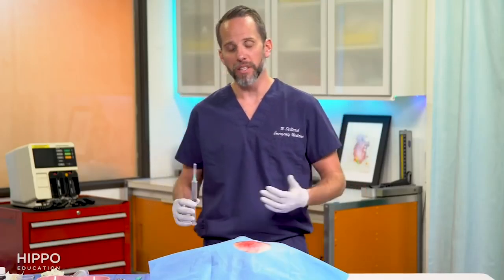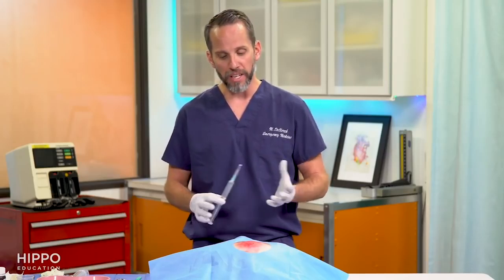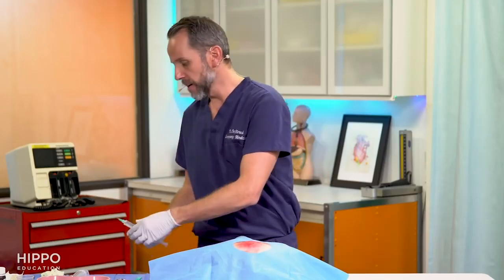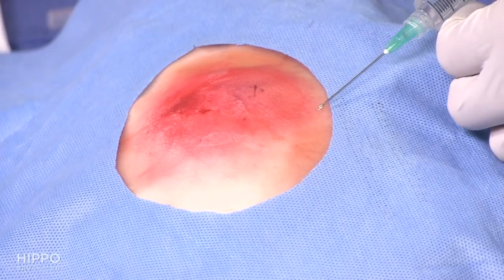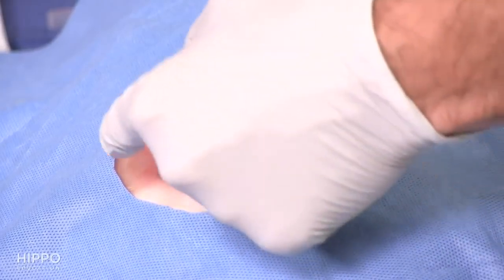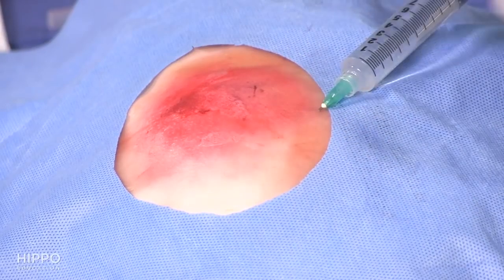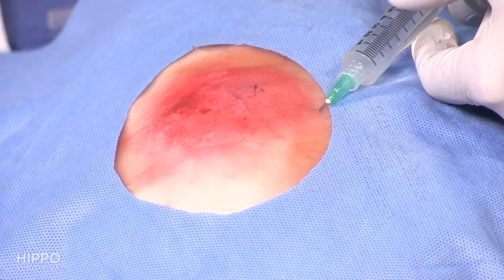The next step is doing a field block. I'm going to use 1% lidocaine without epi — you can use it with epi if it's in the appropriate spot. With a 27-gauge long needle, I like to start at the periphery: make a small skin wheal for good anesthesia there, then advance the needle, forming a field around the cutaneous borders of the abscess. Try to avoid going through infected areas to prevent tracking the infection. Once you go in, pull back to confirm you're not in a vessel, then inject as you advance.